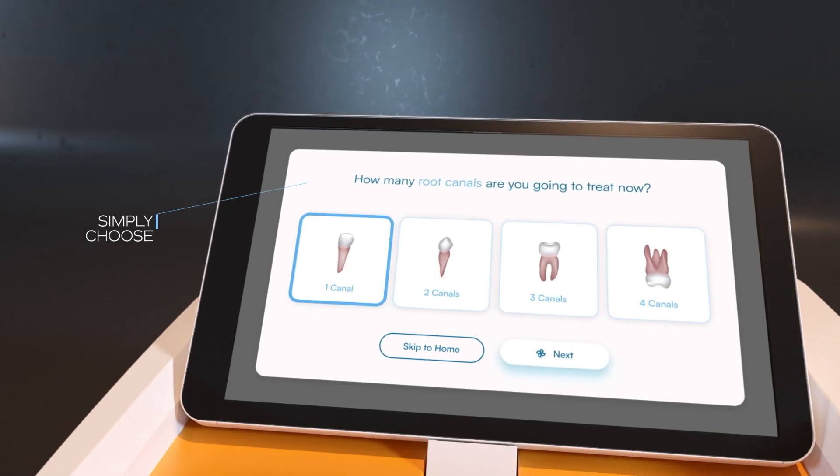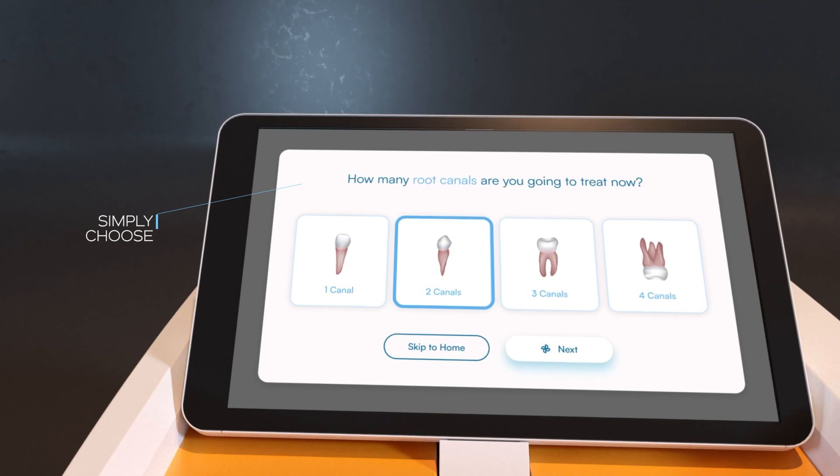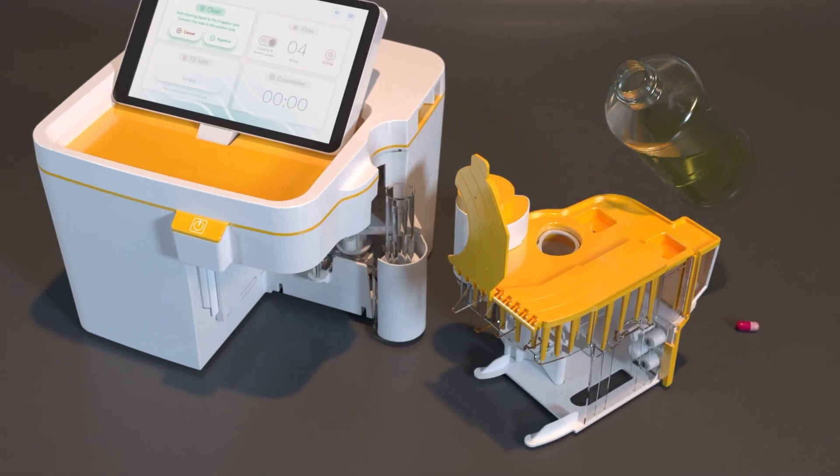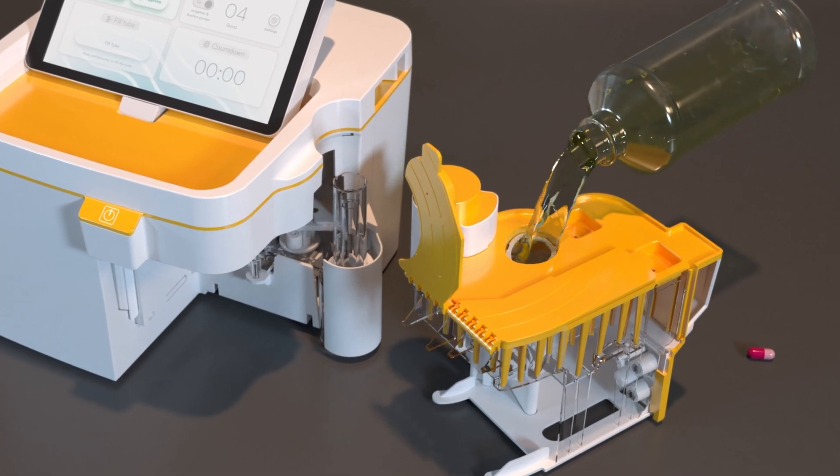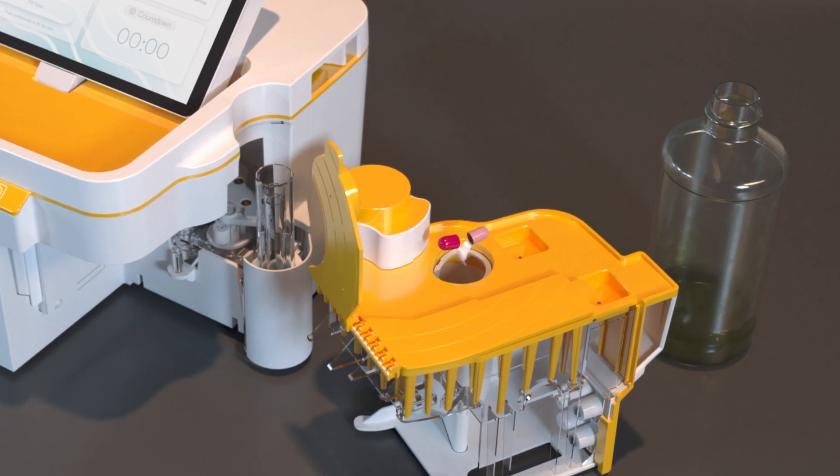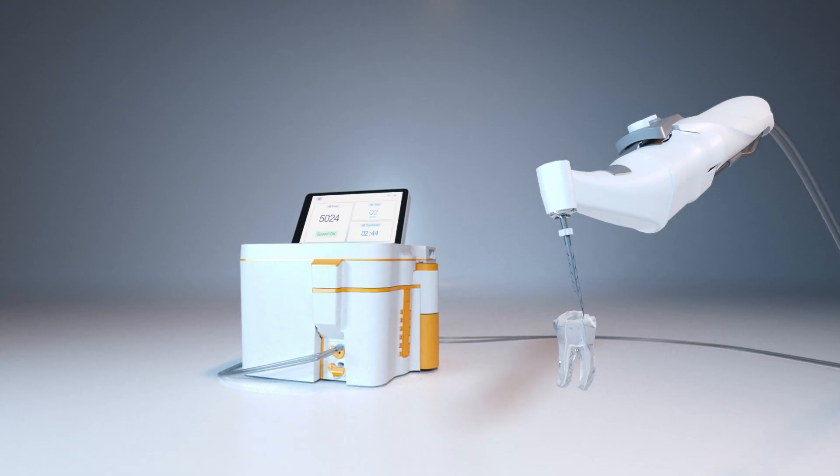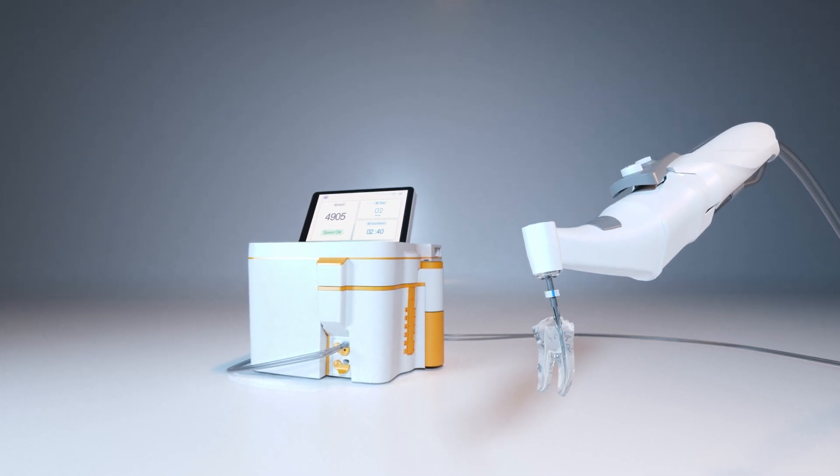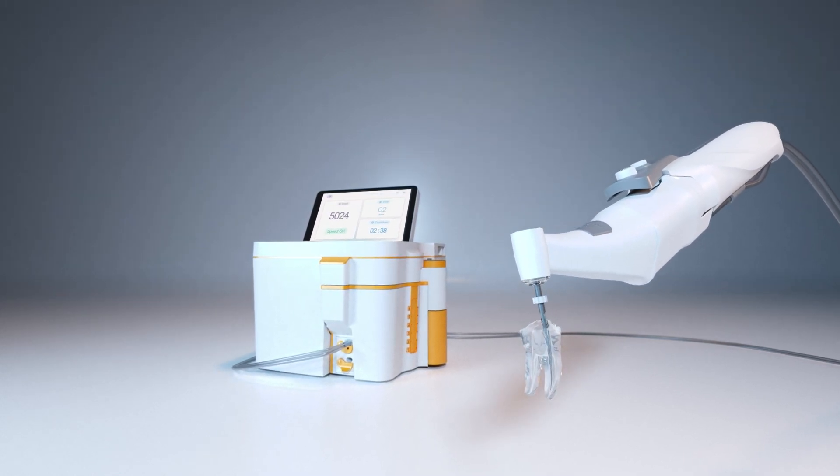To operate the system, the user simply chooses the number of canals to be treated, fills the irrigation tank with the appropriate amount of sodium hypochlorite, adds some HEDP for highly efficient disinfection and the device will mix it all up. Then all you need to do is turn on the endodontic motor and enjoy the best endodontic treatment you have ever experienced.